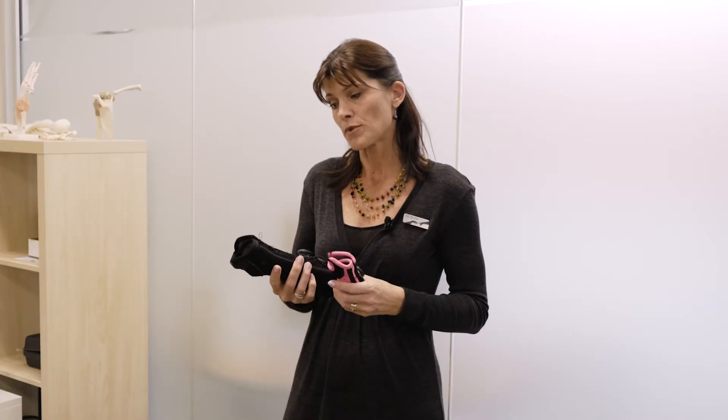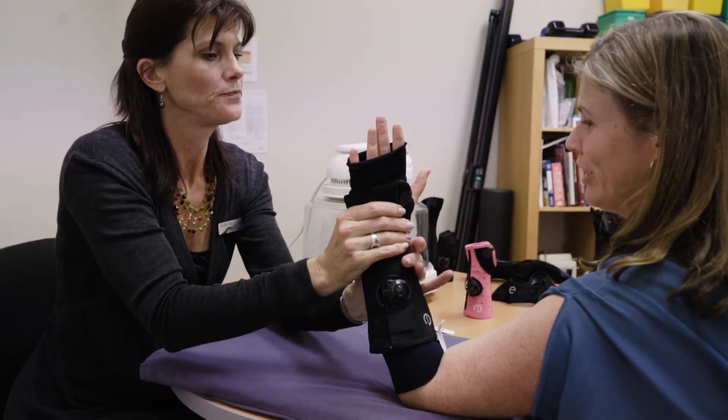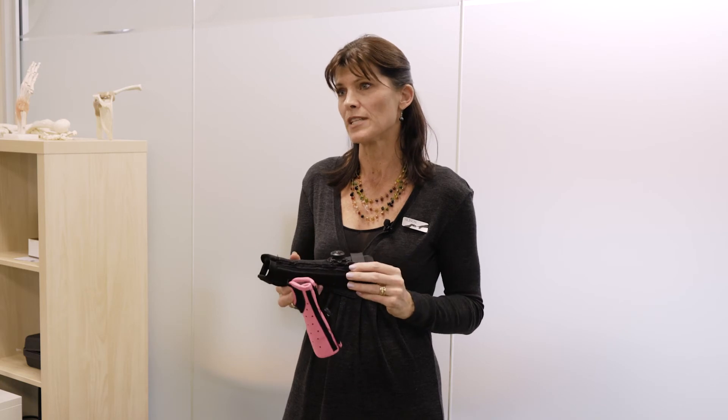We also have them in adult sizes which are a good option for more severe wrist sprains, particularly TFCC injuries, because we can get a nice long cast that limits your forearm rotation so it offloads that TFCC during the healing process, much better than the other off-the-shelf splints. It's much more convenient for the client than having a cast.